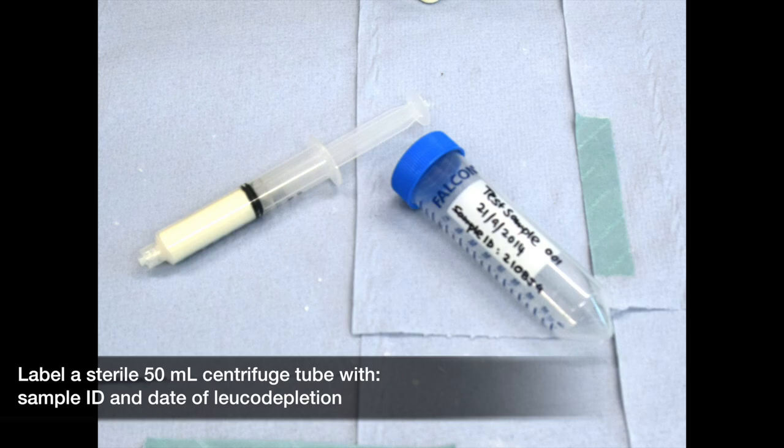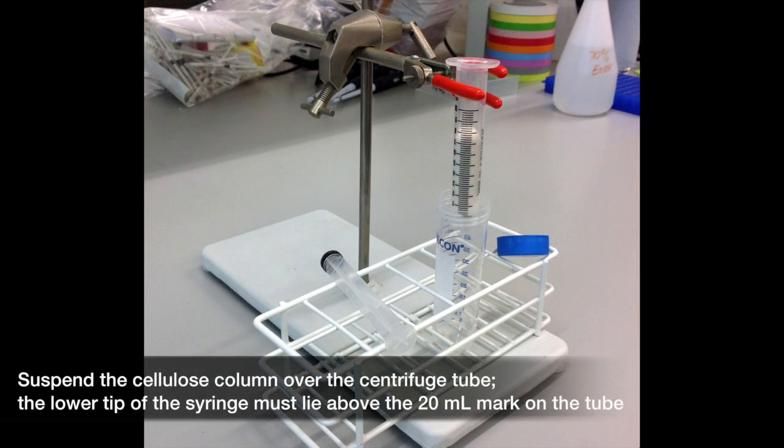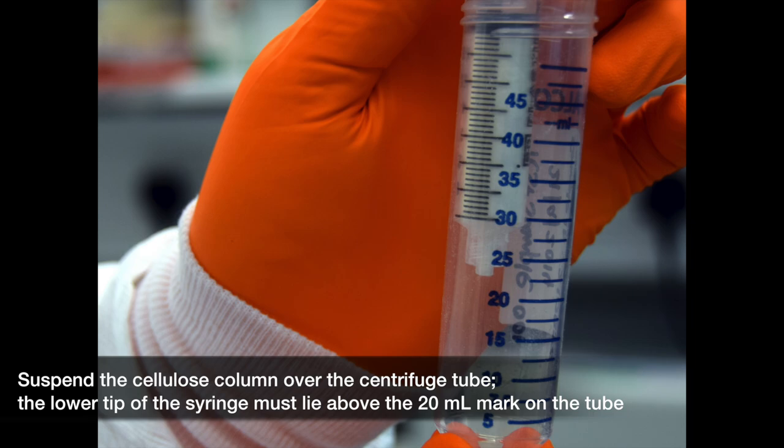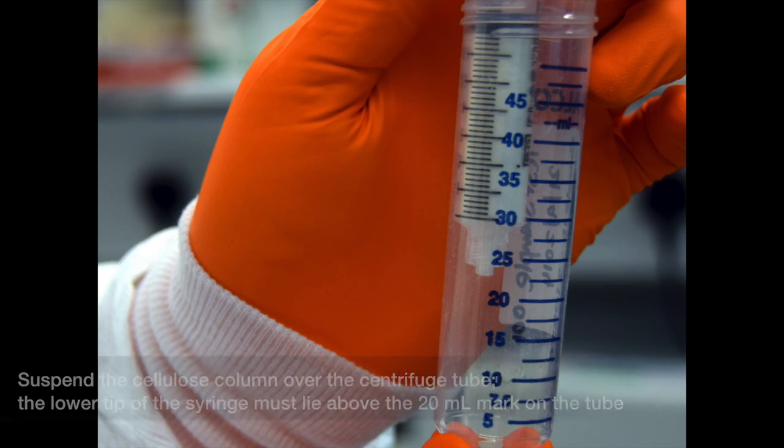Label a sterile 50ml centrifuge tube. Suspend the cellulose column over the uncapped centrifuge tube, making sure that the lower tip of the column lies above the 20ml marking on the tube.